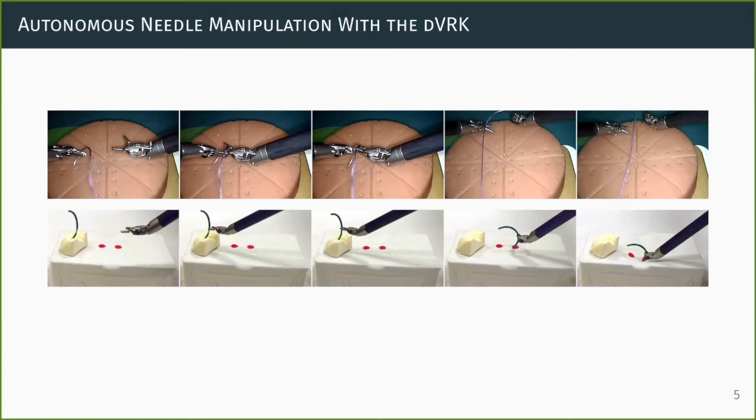The task was quite successful in the sense that we could generalize to differing initial conditions using stereo vision for detecting the needle pose and the insertion points. And I say only moderately successful because the needle did actually not fully pierce this fabric surface that we use, both because we painted the needle such that it was actually quite dull, and the fabric was very pliant.